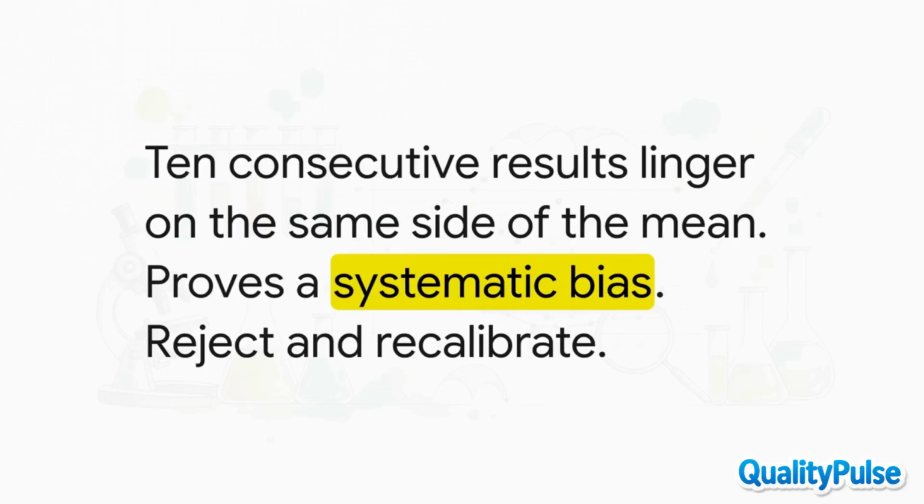Finally, there's the 10x rule. For this one, you'll see a pattern of 10 consecutive results just lingering on the exact same side of the mean, even if they aren't crossing major SD lines. This proves a systematic bias across a broader concentration. Maybe your calibration has just slowly drifted over the last week and a half. Therefore, you've got to reject the run and recalibrate.